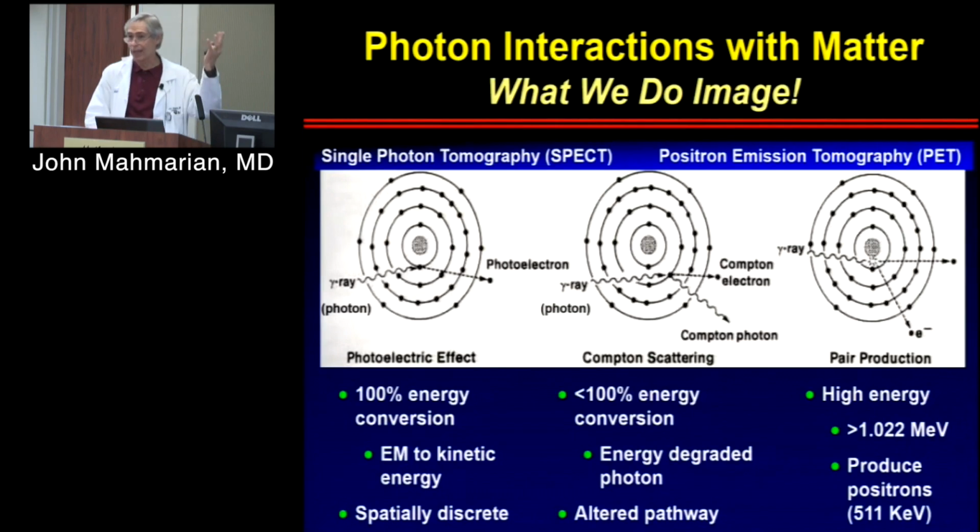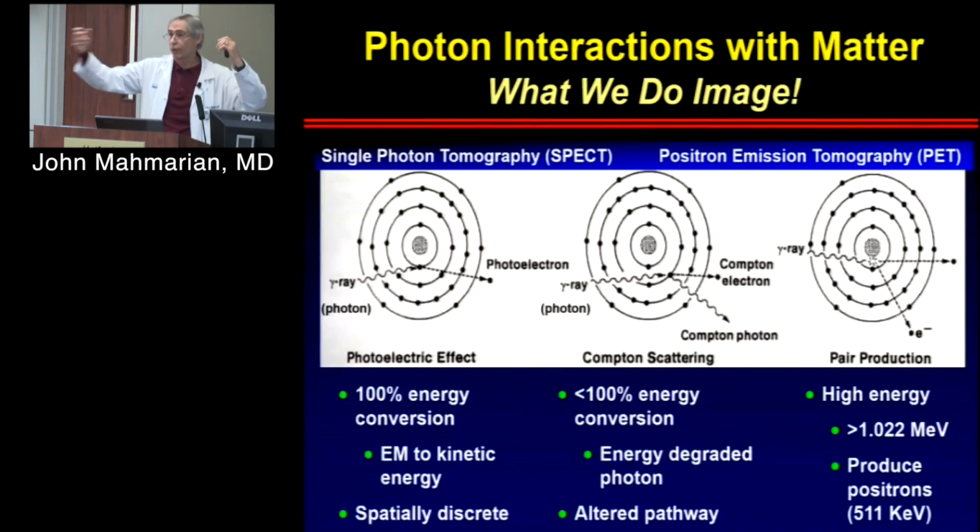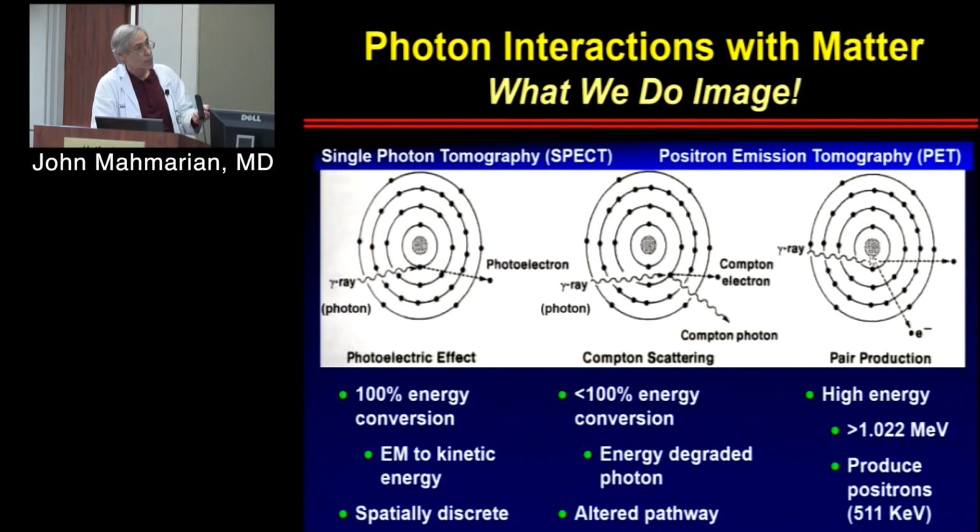You see actually a scintillation, okay? And the photon is absorbed. This is gone. All what you're seeing then is the photoelectric effect in terms of the photoelectron going out. And then, of course, another electron falls down to replace that in a lower shell, from a higher shell to a lower shell.